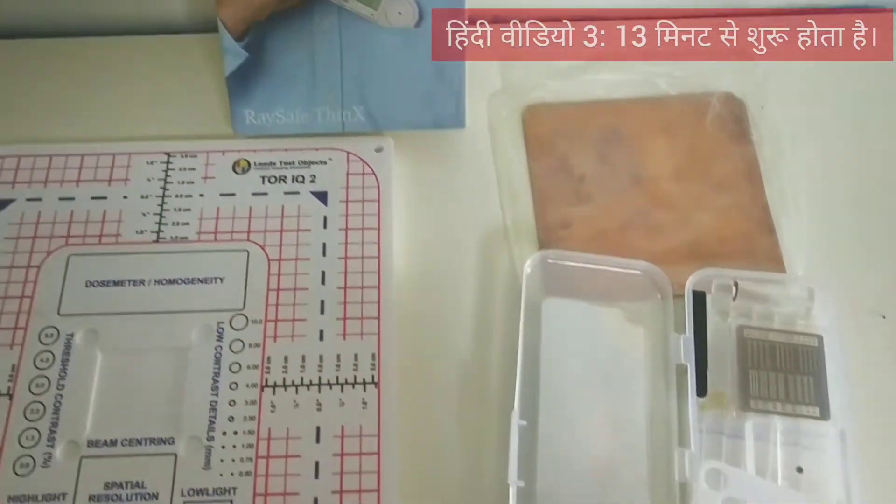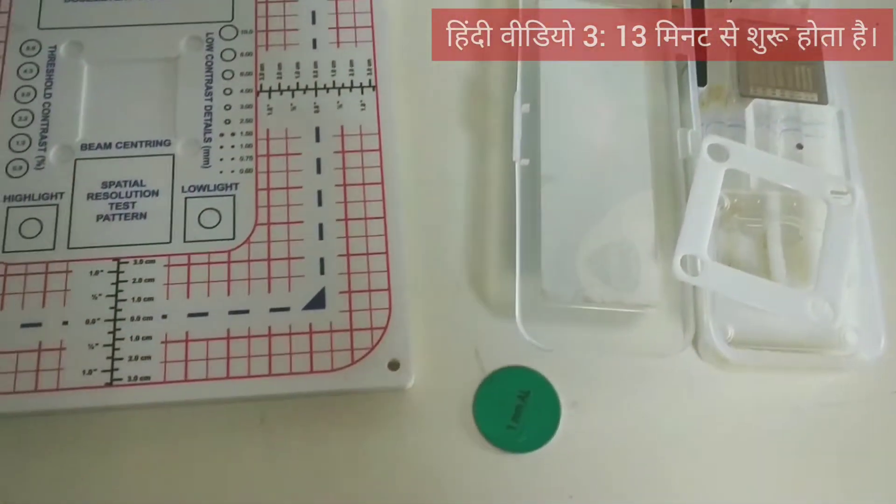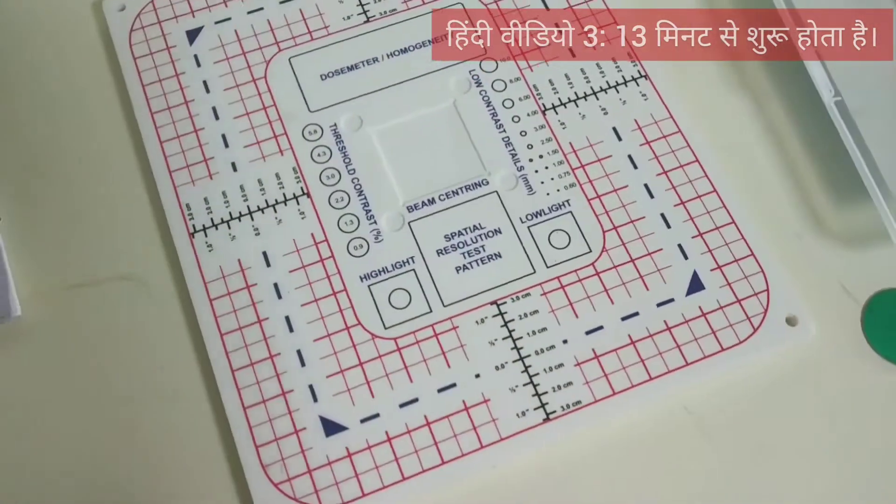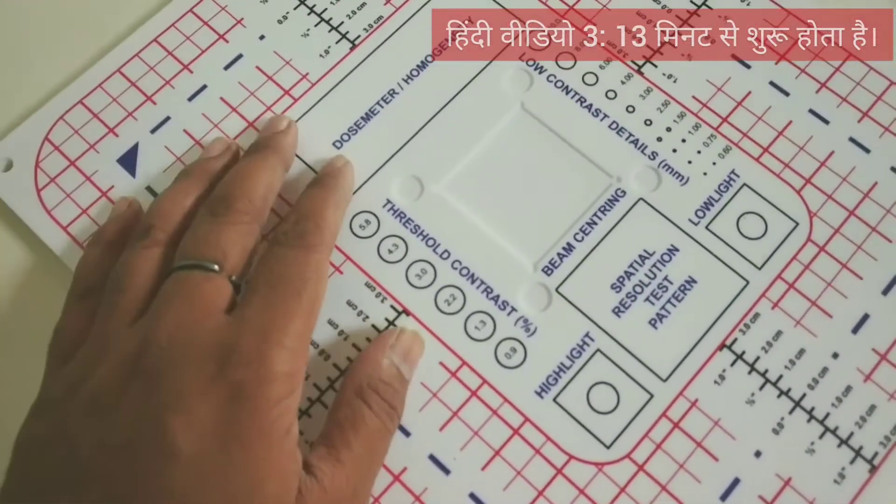In this video, we will be seeing the things required for calibration checking of X-ray. This is a penetration kit. It is used for checking how much dose is reaching the plate.